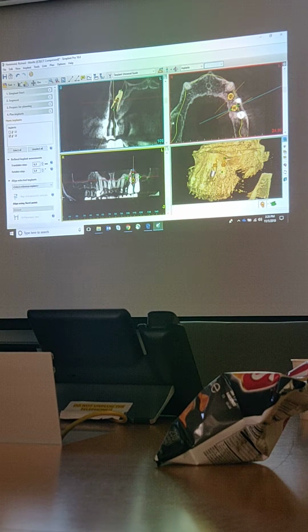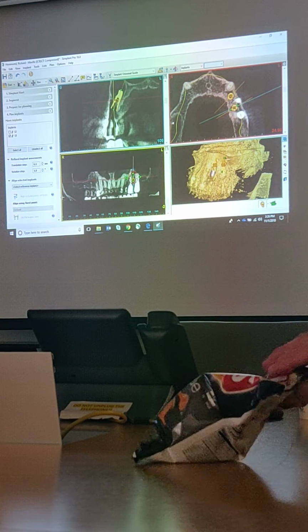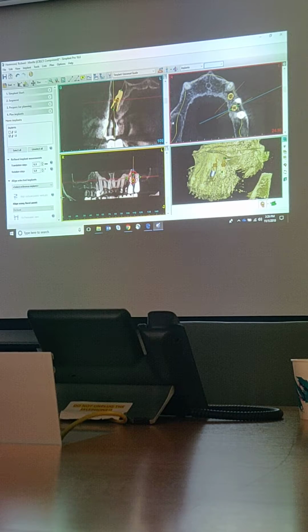And with a Linus abutment, you really don't need them to be exactly parallel. So it's kind of a moot point. Where it matters is on locator cases, so you're not getting wearing of the housings. Or if you're going to do a bridge there, and in the old school days when you couldn't change the angulation, you'd want it parallel, so you'd move one and line them up better. Or simply, if you have a diagnostic wax-up and you have bone, you don't have to worry about it too much.